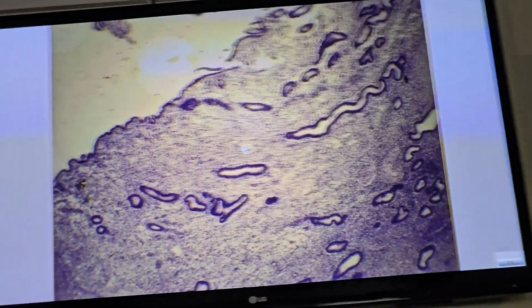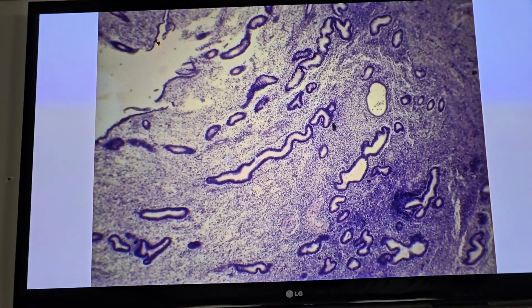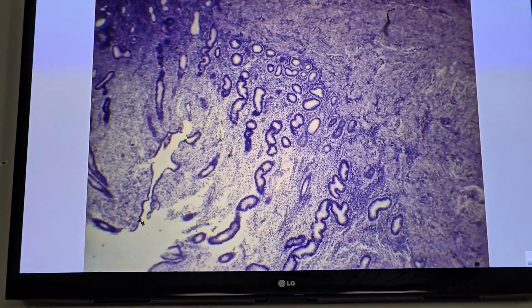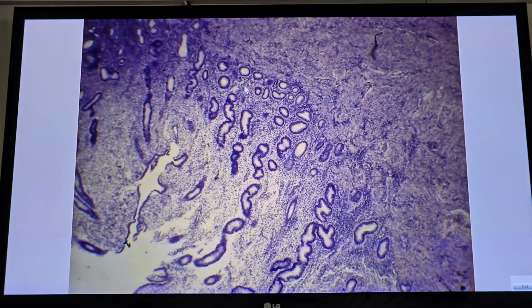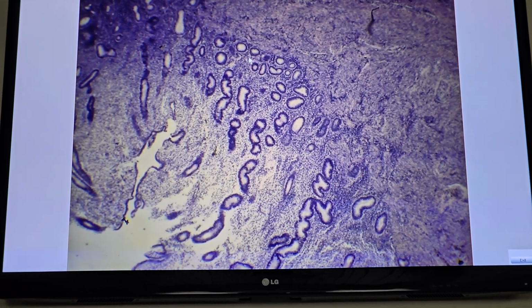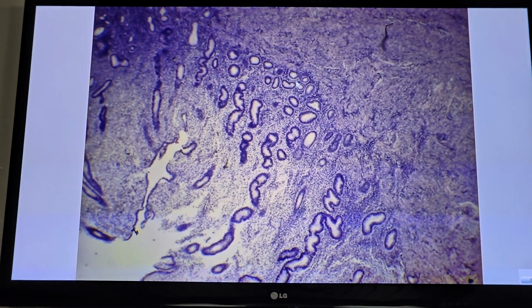The endometrium can be subdivided into two: the superficial functional layer and basal layer adjacent to the myometrium. This is myometrium and this is the basal layer of the endometrium, contain the deep basal ends of the uterine glands.